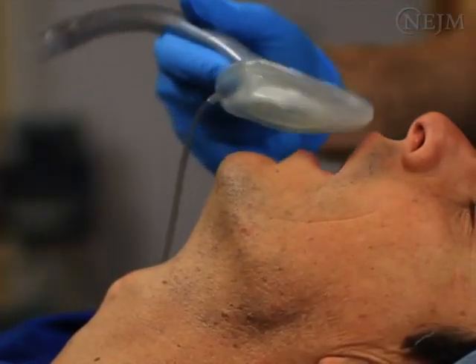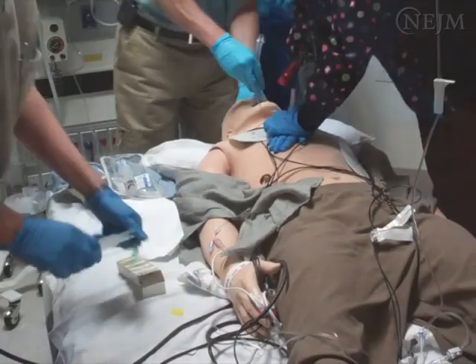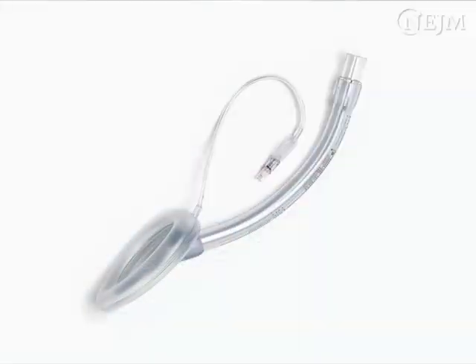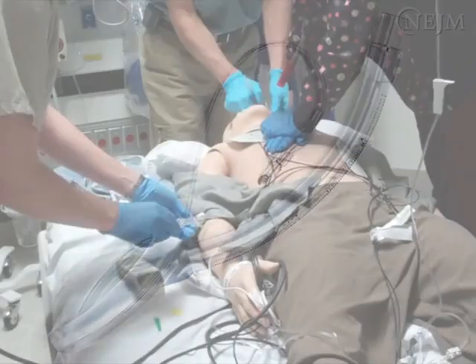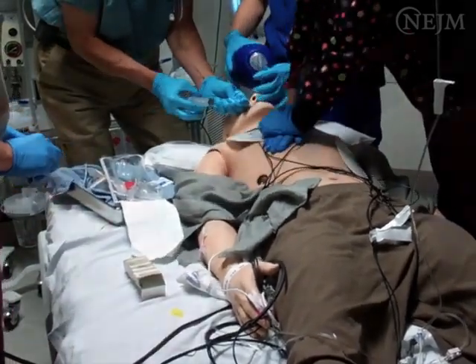This video will demonstrate the placement of the laryngeal mask airway, or LMA, as an emergency airway device in patients experiencing a cardiopulmonary arrest. The goal is to provide familiarity with and instruction in its use so that a clinician will be comfortable using this device to provide effective ventilation for patients in cardiopulmonary arrest.